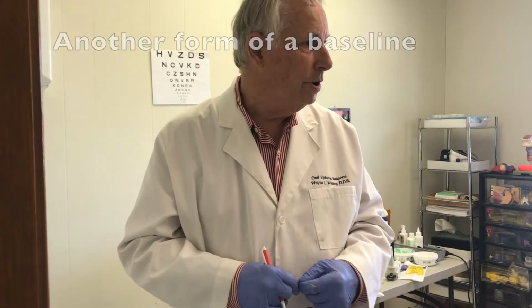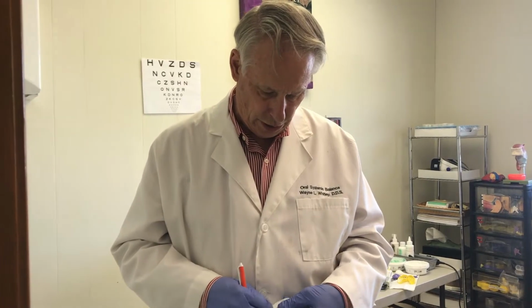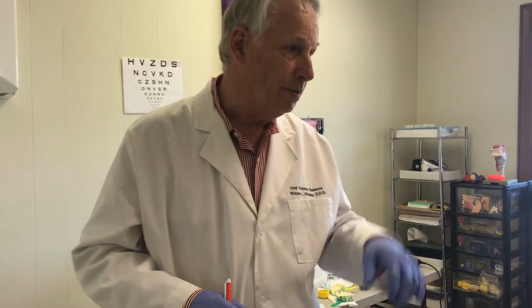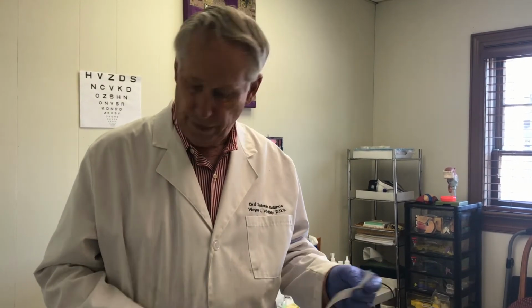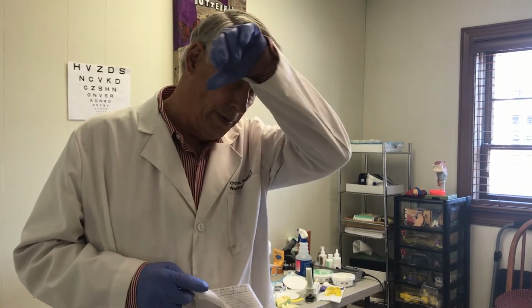Sometimes you pick up things that you wouldn't ordinarily pick up, like his blood pressure is excessively high, or his pulse is excessively high or low. 80 is about optimum. 56 is not good. He doesn't get his blood out to his extremities. He probably has cold hands or feet, as a lot of people with low blood pressure do. When you stand up, blood's not out there where it's supposed to be. You can take a spill.